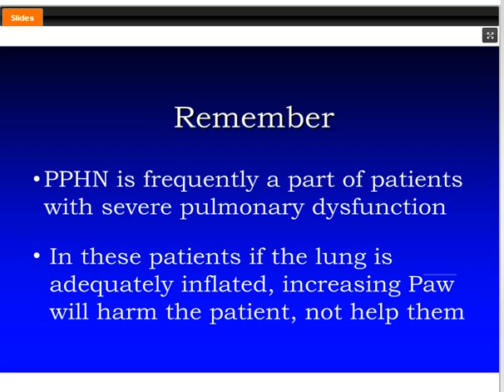So I typically start at 10 hertz, but if my amplitude becomes very small and essentially approaches the mean airway pressure, then I would consider going up on the frequency, which of course would reduce the tidal volume, as a means of not over-ventilating the patient. But personally, I like to start on 10 hertz and then sort the baby out. So if they have clearly no infection, then many of them can be managed very effectively on 12 hertz.